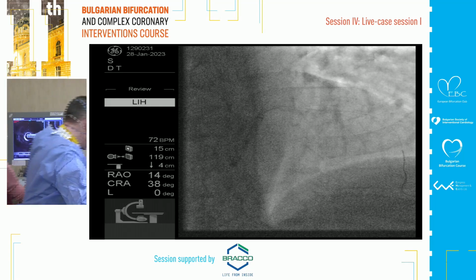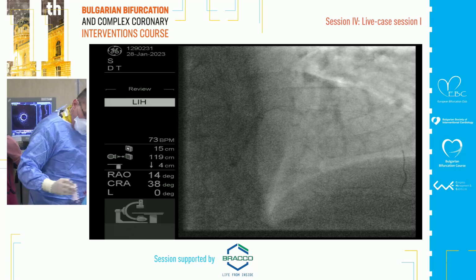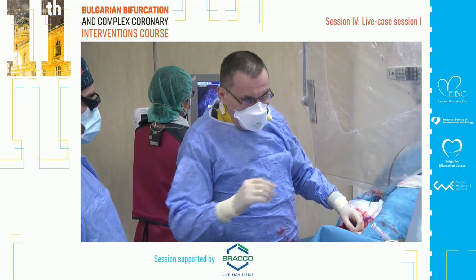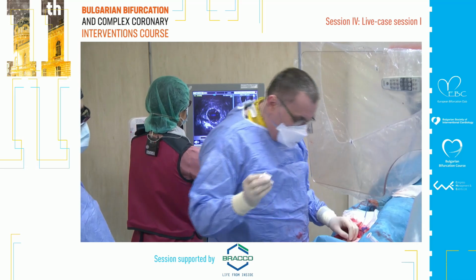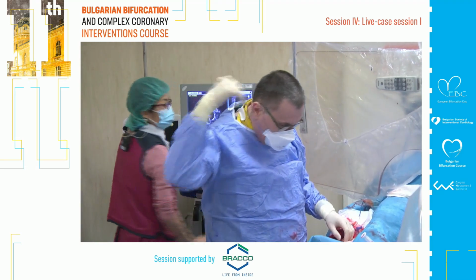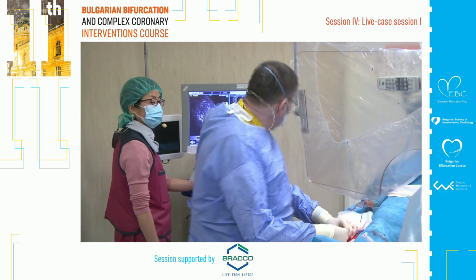One thing you should appreciate is that the vessel proximally is extremely tortuous, and during the manual pullback it jumps exactly at the ostium of the LAD. There is a more than 90-degree curve there, and it is very difficult to assess.